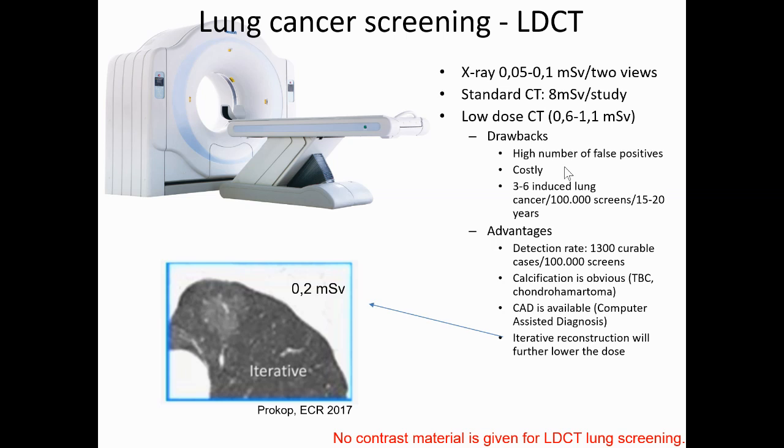The advantage is that it's actually high definition imaging, meaning that 1 to 1.5 millimeter slices are generated, and on those images it's very easy to detect abnormalities. CAD is available and we are actually using it, and it's interesting where the technology is going.